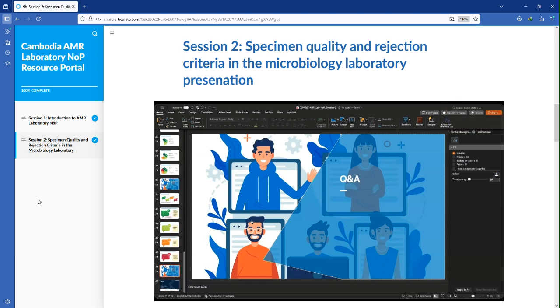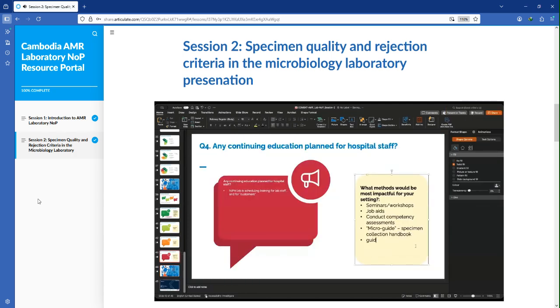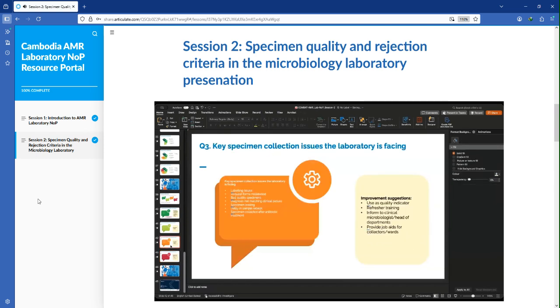Currently, we have the specimen rejection criteria, but if the doctor or clinician still wants to do it, we should have a process for it, and we should add another comment to the specimen as well. Sometimes we reject it because the specimen is poor quality, but the doctor still wants us to process it, so we should process it, but with a comment of caution as well. Yep.